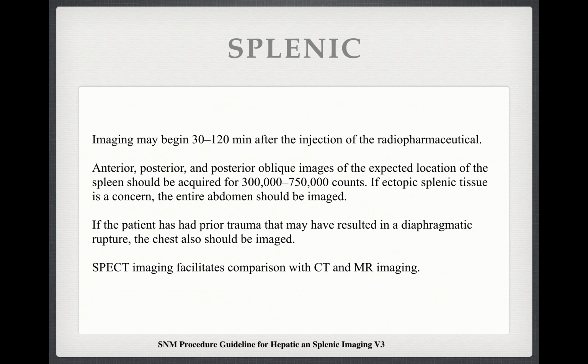Okay, dedicated splenic imaging is, however, best performed with heat-damaged red blood cells, because that's the whole purpose of the spleen, to remove bad red blood cells from the blood pool. And so this is superior to conventional sulfur colloid imaging.